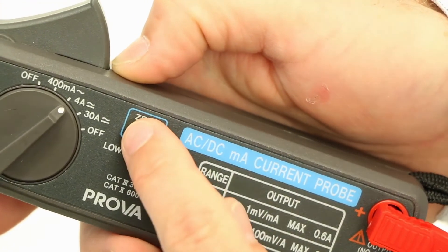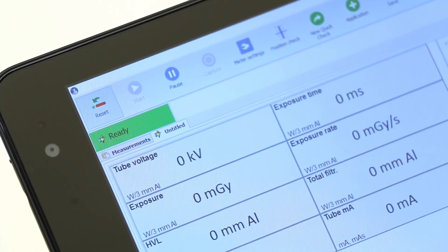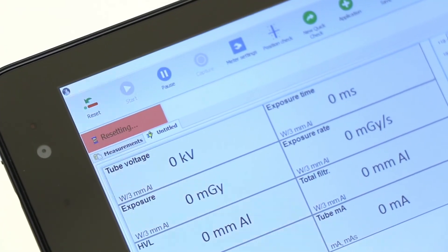Press 0 on the Mask 2. Press Reset in Ocean. And now you're ready to measure.